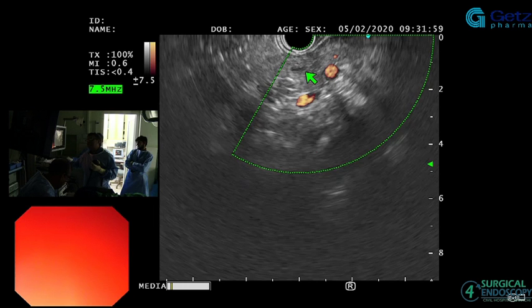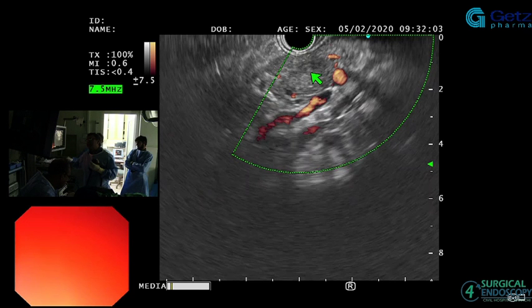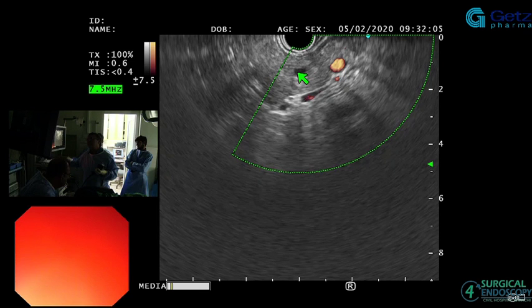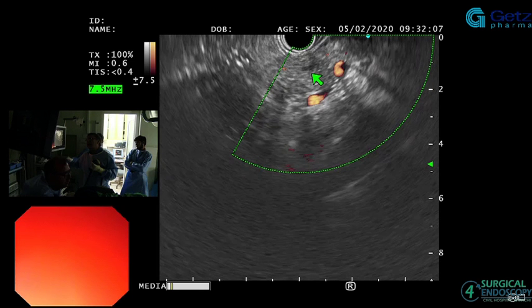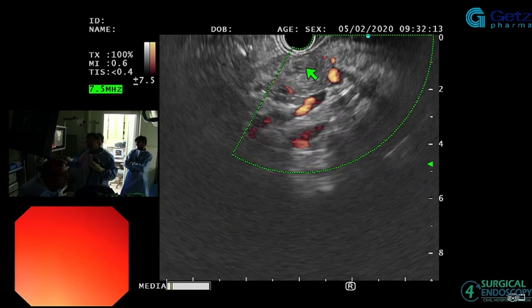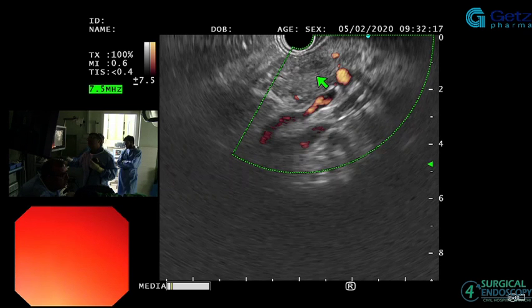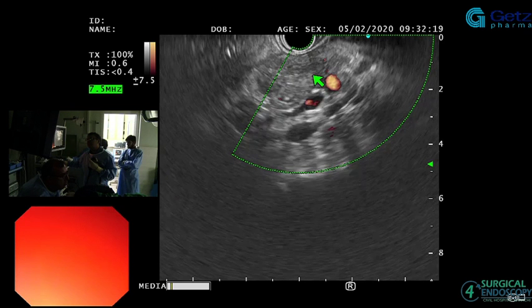Do you see how that disappears? Yeah. No, here, and all of a sudden it's a white spot here, no duct beyond that. Yeah. So either that indicates it's a tight stricture or it's disconnected. So I'm going further towards the right, and then we start seeing that chronic fluid collection.